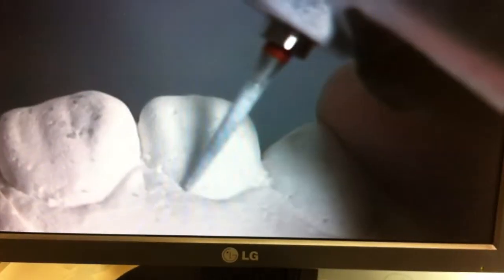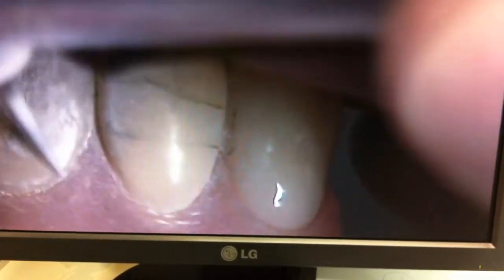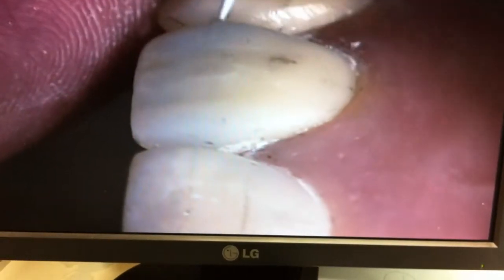You go up here, and then all of a sudden you flip, you're straight, then you flip, and you work here and there. So when I get to the distal, what am I going to do? I'm going to flip. Yeah, you have to connect it. See that? That makes the distal lobe stand out. That by itself makes the distal lobe stand out. Compare.